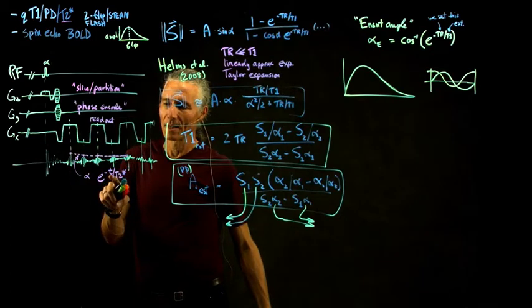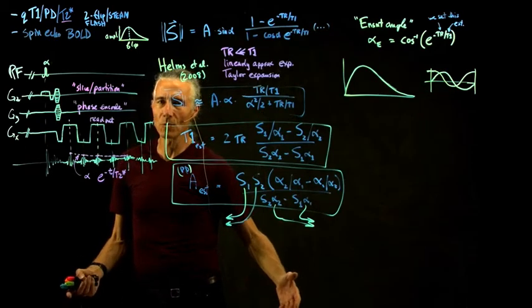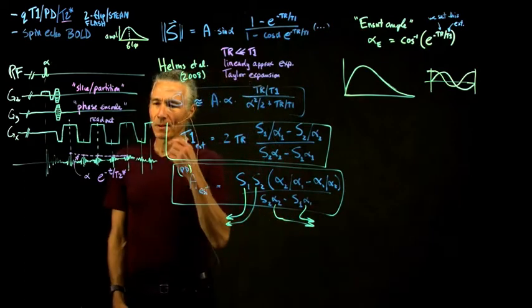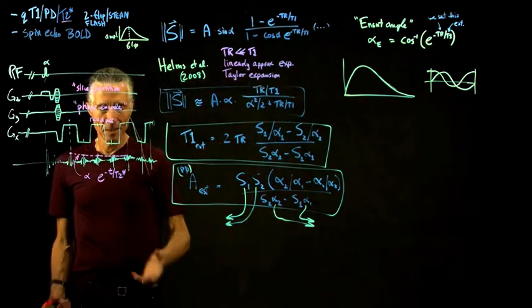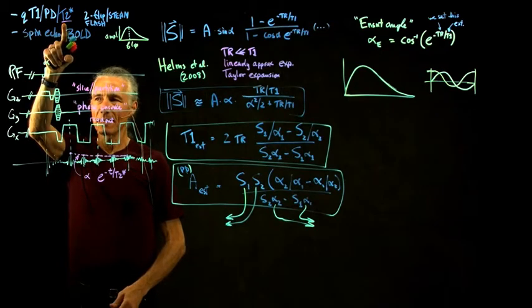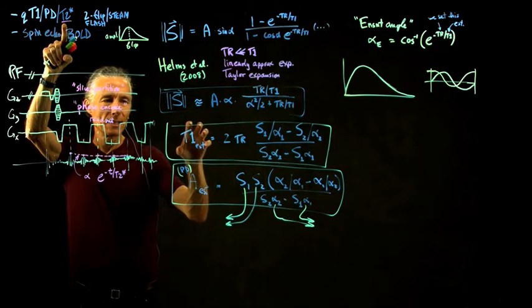and figure out this T2 star time constant, as opposed to just getting a T2 weighted image, which emphasizes T2. So that's a third thing that we could calculate, using a slightly different method than the one for calculating the T1.